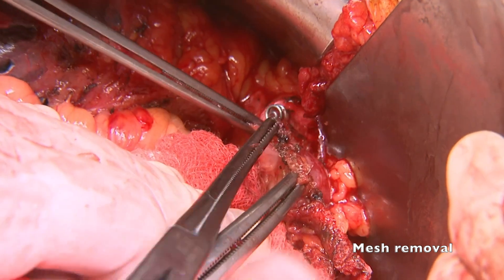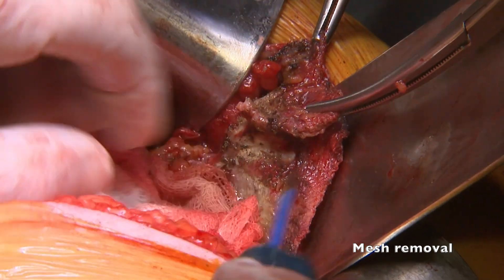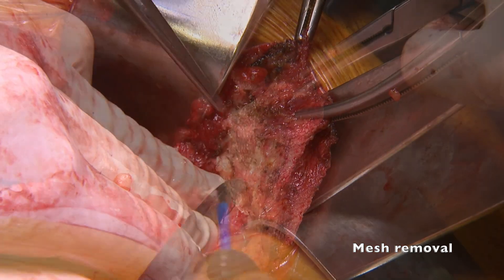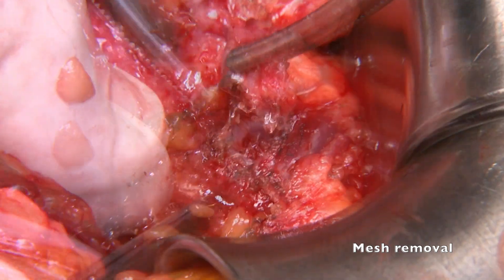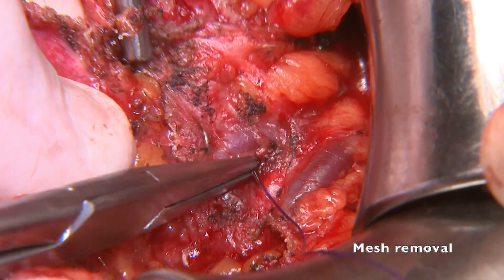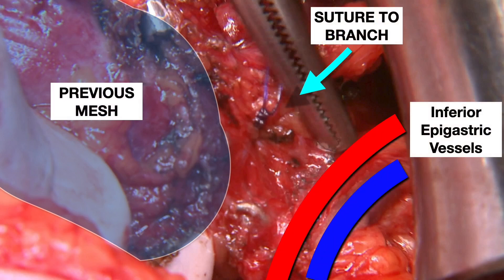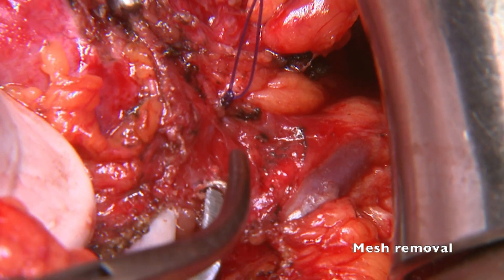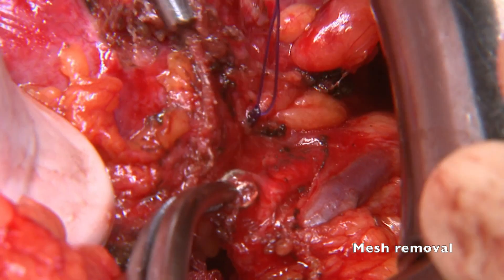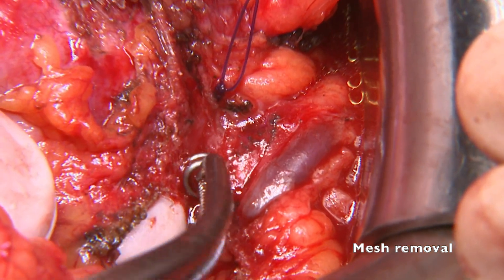A number of tacks had to be removed one by one, just unscrewing them. It is relevant to carry out the dissection peeling of the retroperitoneal fat attached to the mesh. Near the inferior epigastric vessels, we found some more dangerous tacks. We first performed suture control of a branch from the mesh to the inferior epigastric vessels. We then decided to go ahead with a tack just touching the intima of the artery, with the idea of ligating the vessels in case of bleeding. Fortunately, the tack was removed without any disturbing bleeding.